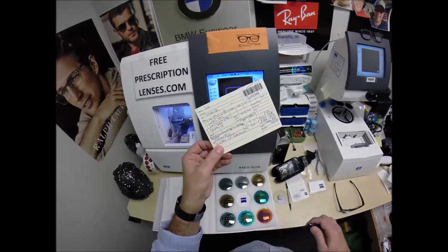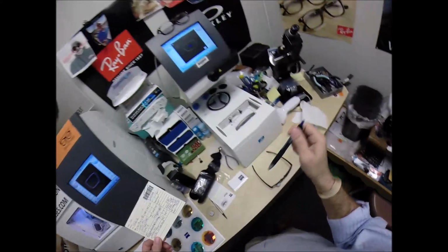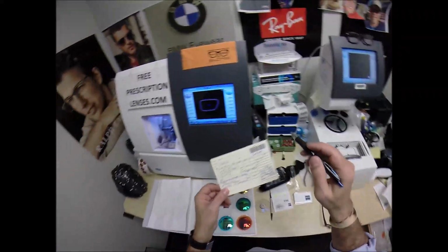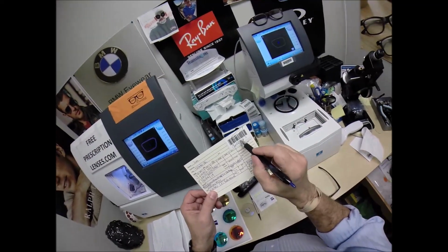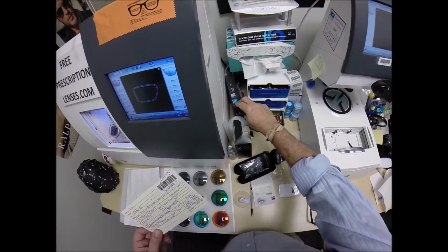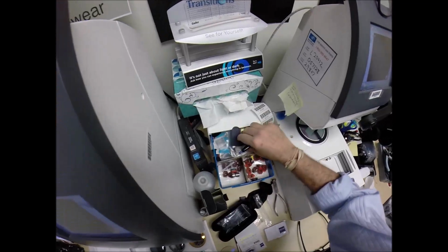To my buddy in Bosnia-Herzegovina, if you're using the barcodes, by the way, I've got a company that I order from. They will send you a roll of these barcodes. Your machine will store all of these. Store that in there. Now, it has a memory of 1,000. If you do not have the SE box, which is another $400 or $500, you can always store your information.